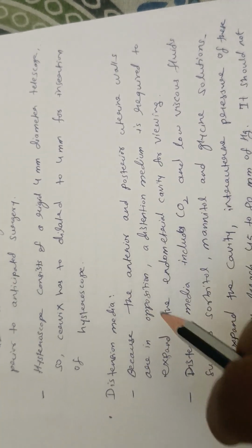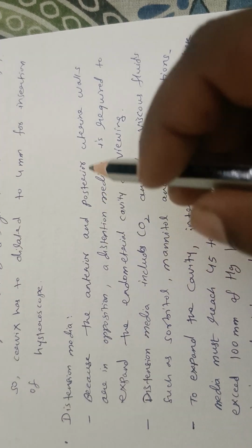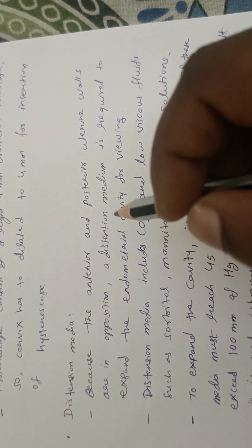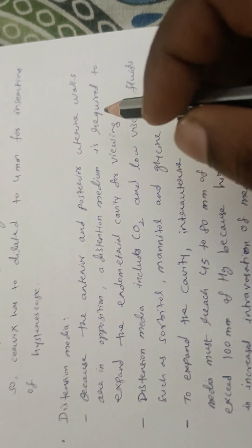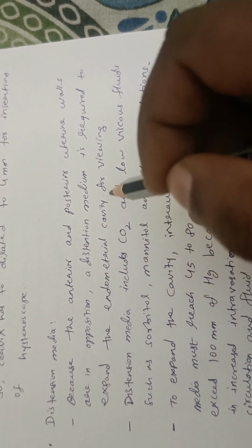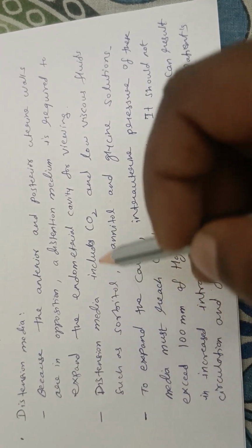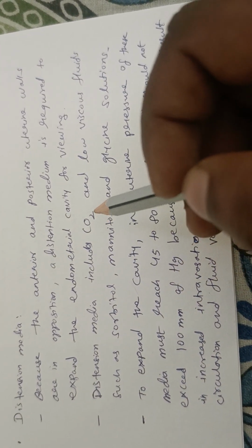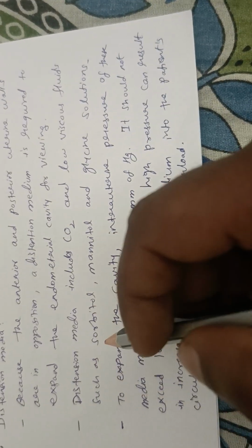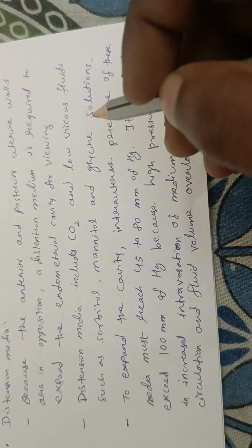Distension media. Because the anterior and posterior uterine walls are in opposition, a distension medium is required to expand the endometrial cavity for viewing. Distension media includes carbon dioxide and low viscous fluids such as sorbitol, mannitol, and glycine solutions.